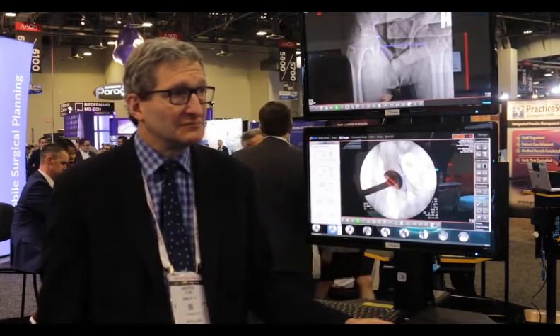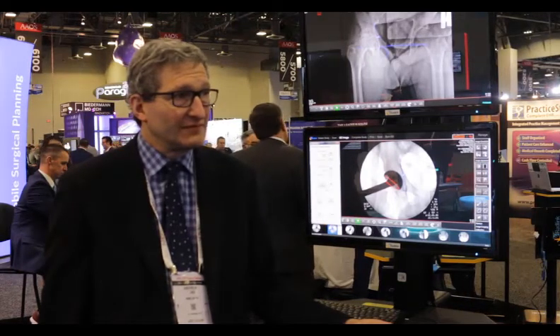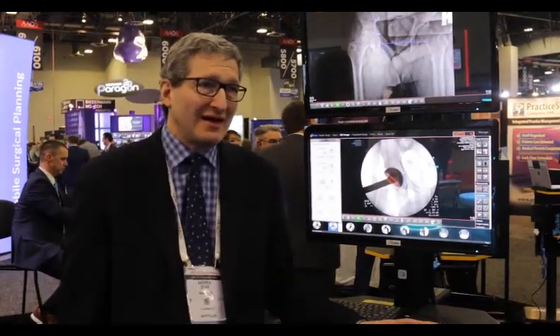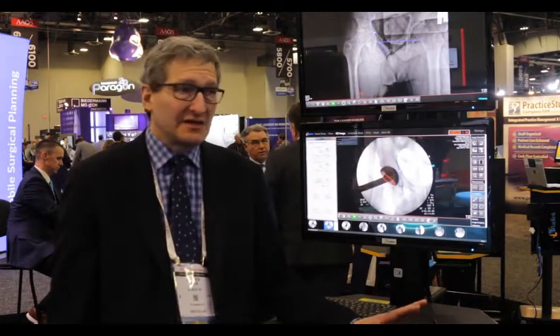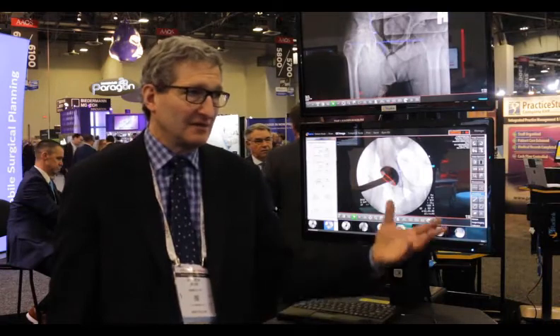When you're evaluating limb length, why do you like to look at the full AP pelvis rather than, say, an overlay? Well, I think you kind of look at everything, but we rely a lot on pre-op and post-op X-rays and where we're trying to get to. So the overlay technique is a very valid one, and we support that in the RadLink format.